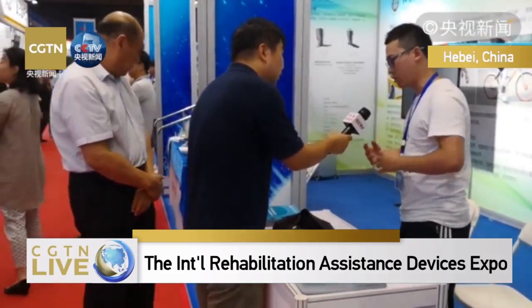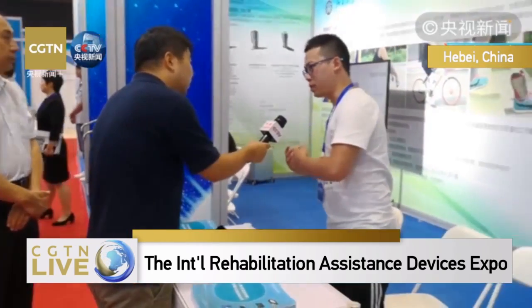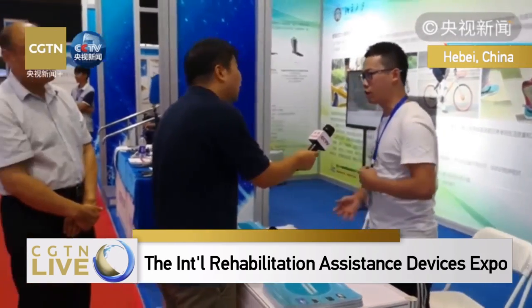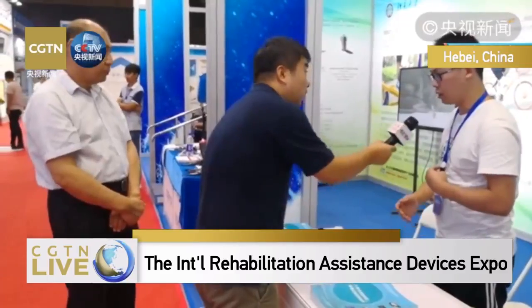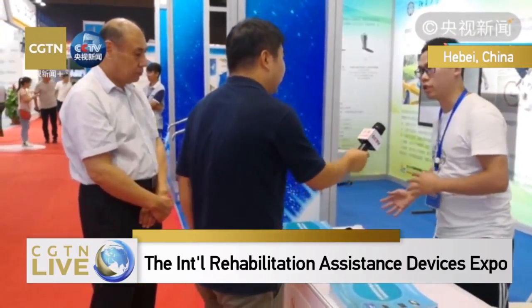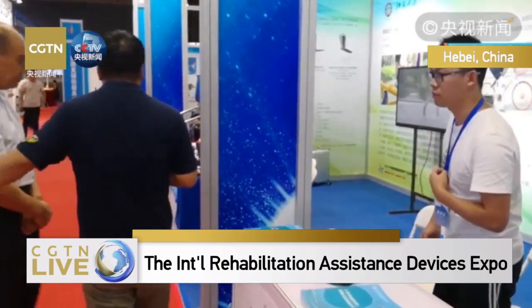It has a sensor that can detect the motions of the user, the speed of the user and the leaning angle of the user, so as to assess the risk of falling down. If it comes to a tipping point, the airbags will come out instantly to prevent severe injuries from happening.